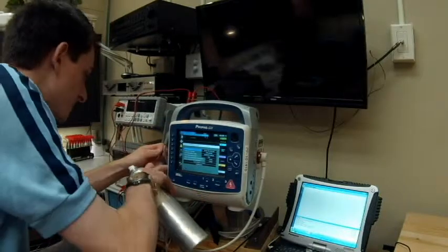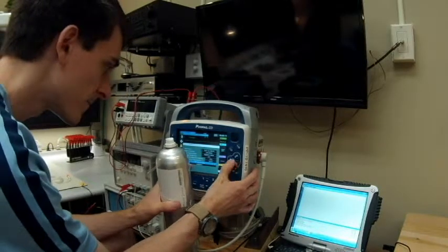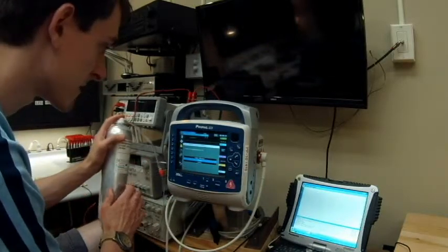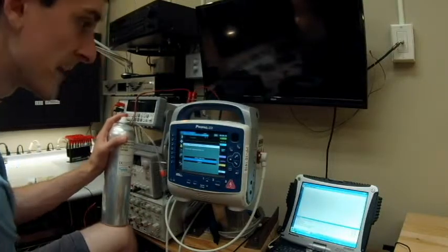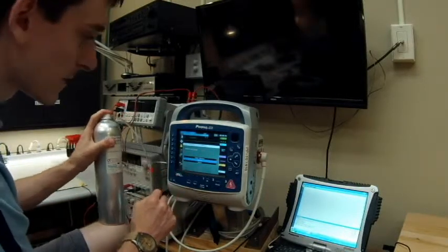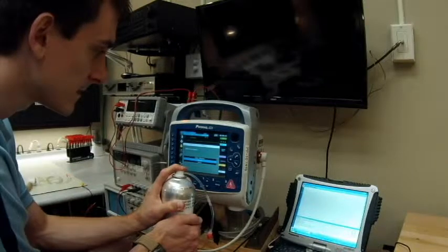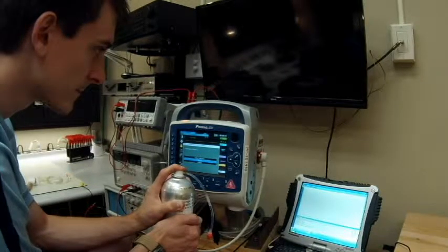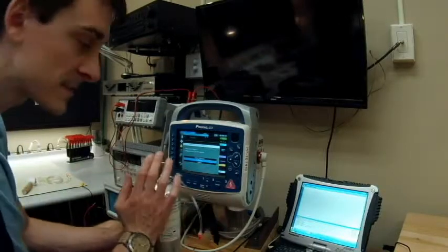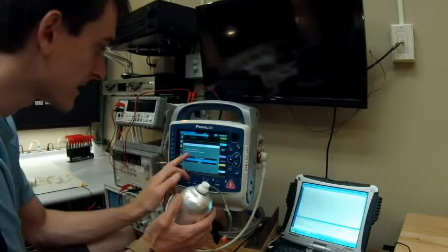We go down to calibration and hit 'calibrate.' I won't start the gas until it says to — it will say 'please wait, module warming up.' Once it's ready, I'll begin the gas process. Calibration is in progress, so I'm depressing the cylinder and placing gas inside the unit. It now says 'calibration gas can be removed.' We're not going to hit anything — just stay there and it'll confirm if it passed.